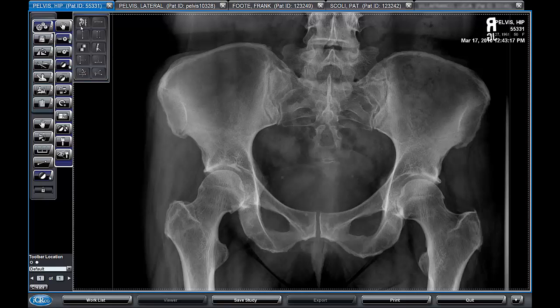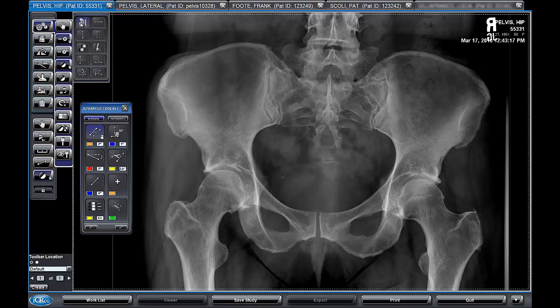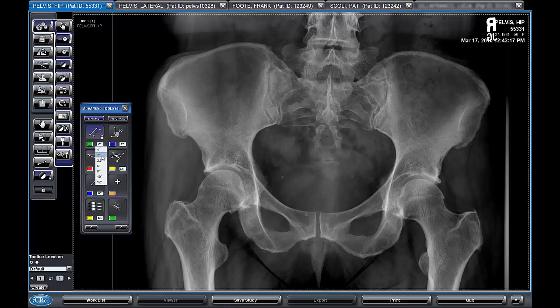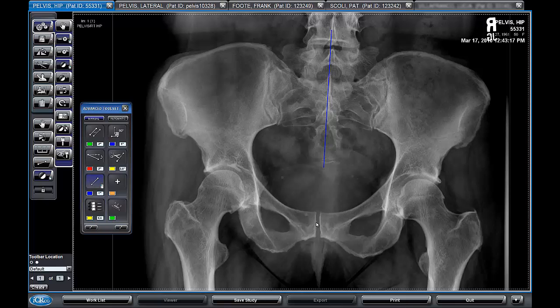In the advanced tools, we have a button for the advanced tool set. These buttons allow you to change the color and the line length for these tools. Starting with the fixed length line — if we want a line of six inches, we can just drag this out and it will snap to six inches. If we want one that's one inch, we can get that as well.